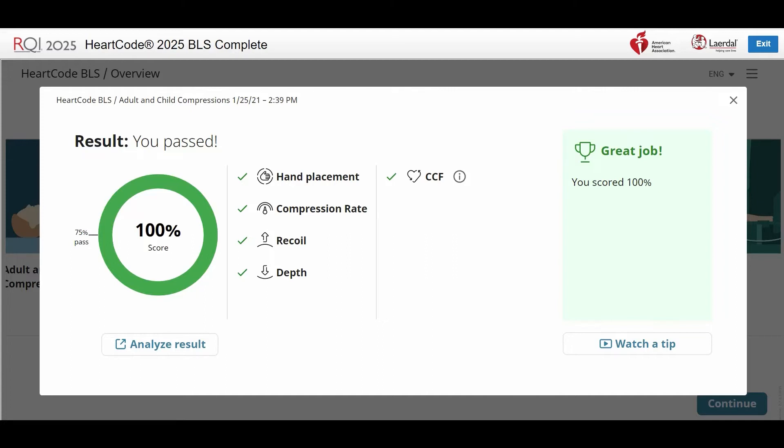A green check by the metric confirms that you have met the objective. If you have a perfect score, the box on the right will be green and display 'Great Job.'